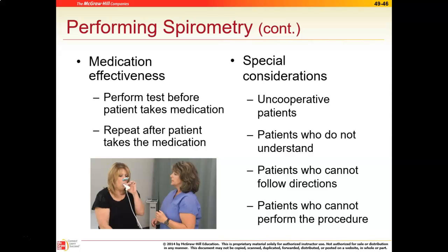All right, and so it can be difficult sometimes for patients to do this, and so that's why the demonstration process is really important. You may have to go through and show the patient how to do it so they can see you and actually have a clue as to what you're talking about. You're also going to have to coach them through. For that 6 seconds, it can be tough.